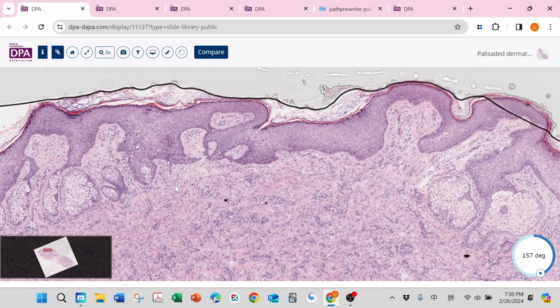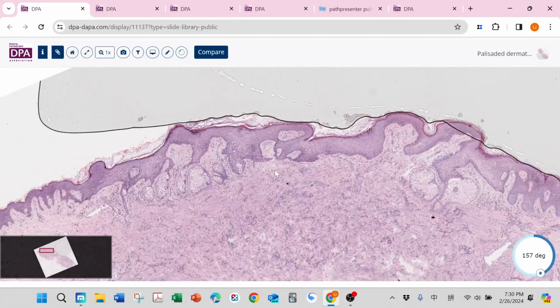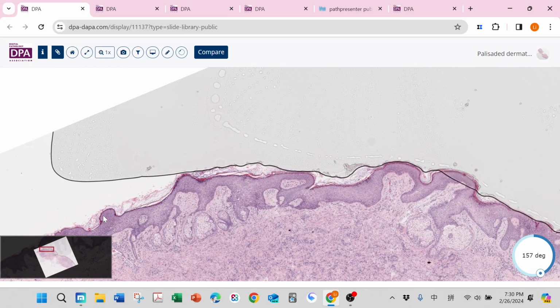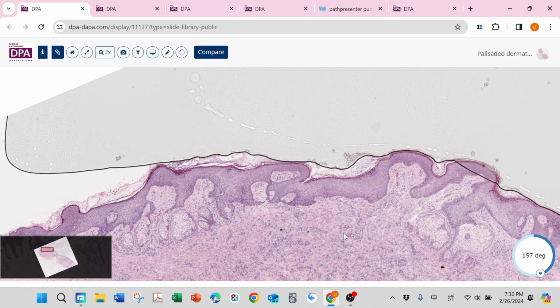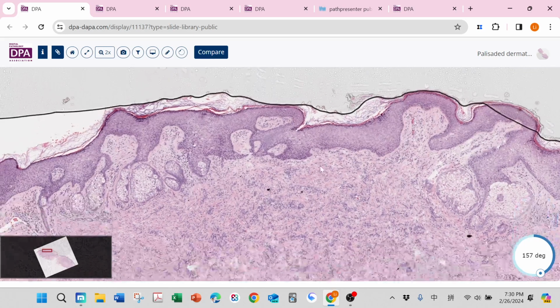So in dermatofibroma, you can get a sebaceous gland reaction and also this follicular induction on top of the dermatofibroma. Just imagine if you get a shave biopsy something like this. You may wonder what it is, but when you see this sebaceous induction, follicular induction, with spindle-looking cells entrapping the collagen, even in this superficial biopsy, you can tell this is dermatofibroma.